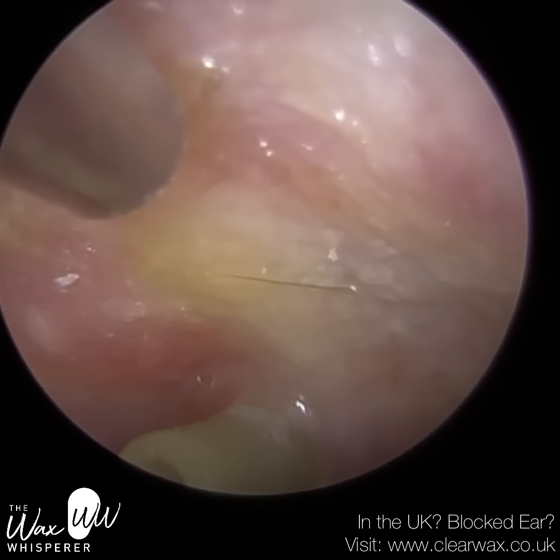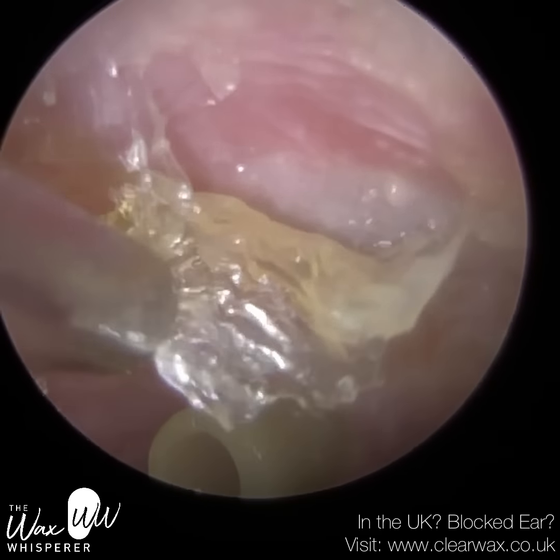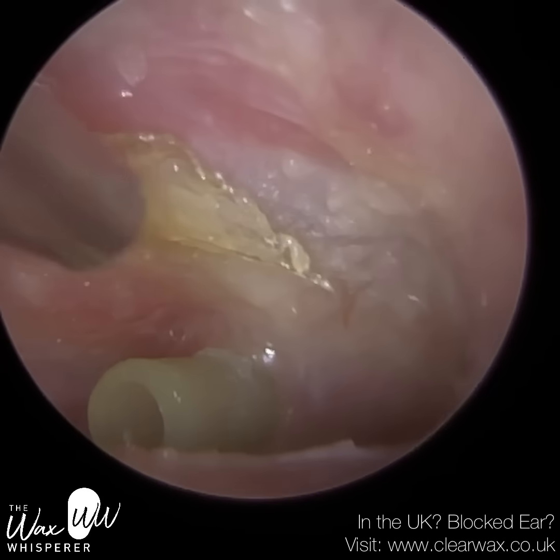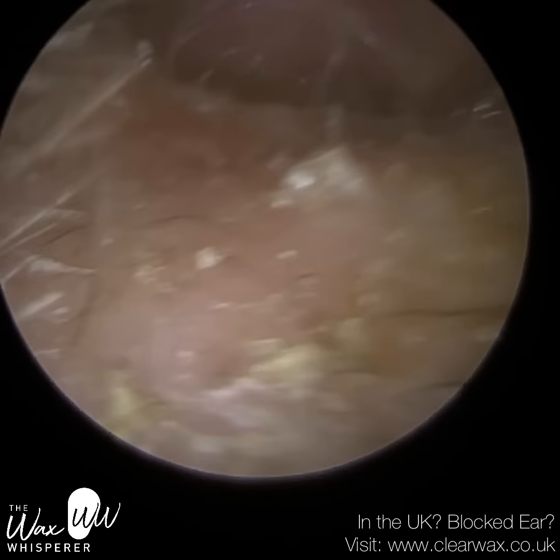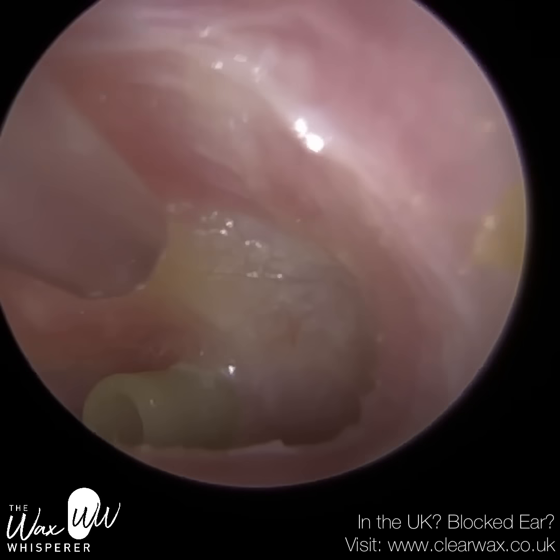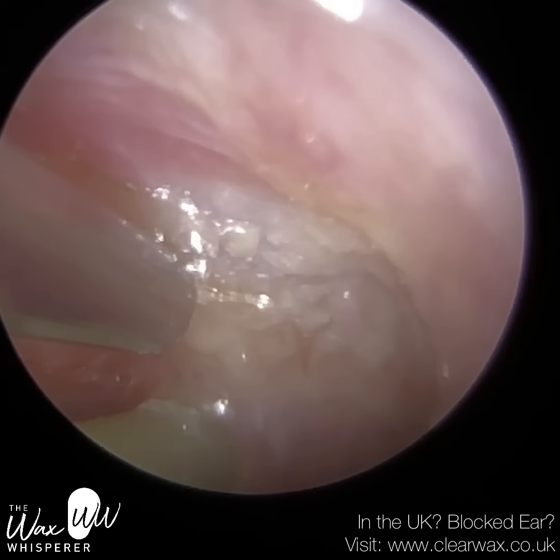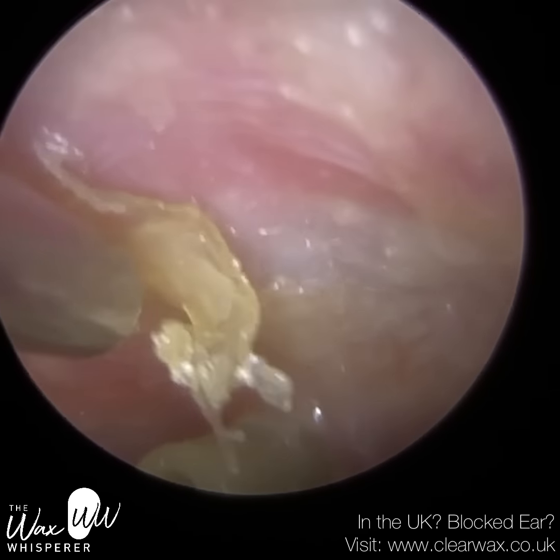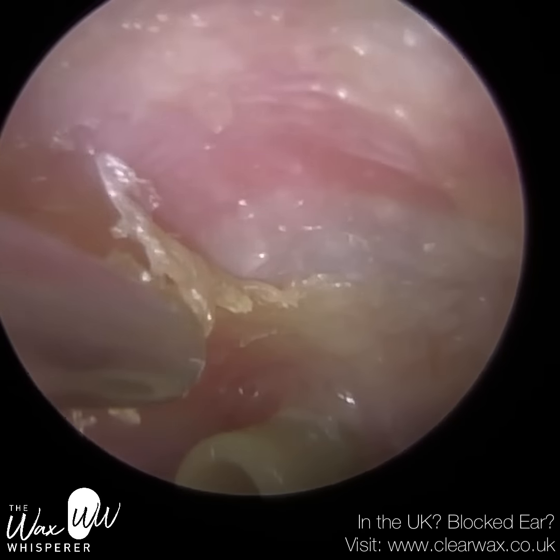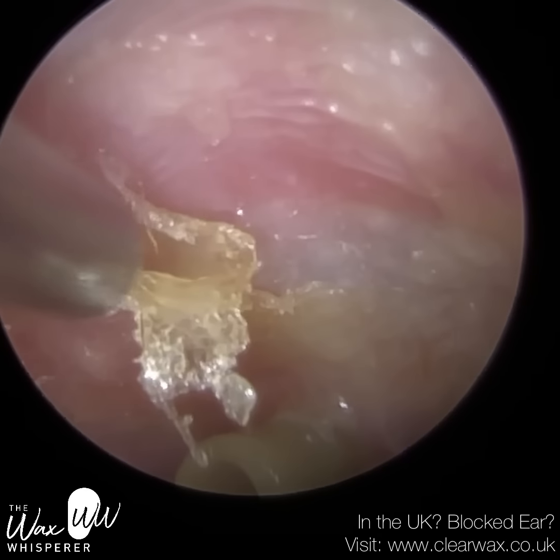But in this patient, their eustachian tube is completely blocked, so air can't enter the middle ear via the back of the nose. And the cause of that has been there for most of their lifetime. The ENT doctor feels it's due to just an anatomically narrow eustachian tube. The resulting cause of a blocked eustachian tube is that there's no air behind the eardrum, and that creates a vacuum effect. And the vacuum effect causes the eardrum to be sucked inwards, a bit like when you're on an aeroplane, which can cause earache, tinnitus, vertigo, hearing loss, and it's become an issue for the patient over the years. And so they had grommets fitted. Now, I'll come back to that in a moment.